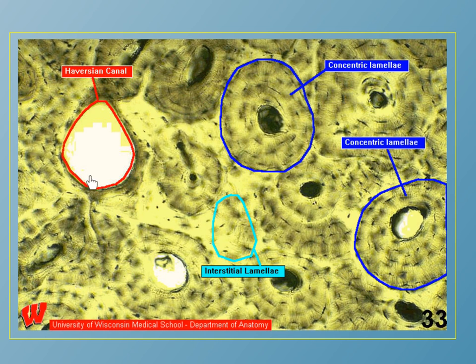And this is also a picture for the ground compact bone, and these are the Haversian systems formed of the concentric lamellae. That's to say they have a common center. And these lamellae are formed of these lacunae containing the osteocytes, of course, and in between we have the calcified collagen fibers. This is the Haversian canal, and these black areas here are the lacunae, and the fine threads are the canaliculi. We don't have any living tissue in this slide.